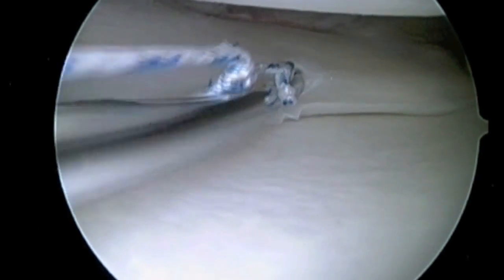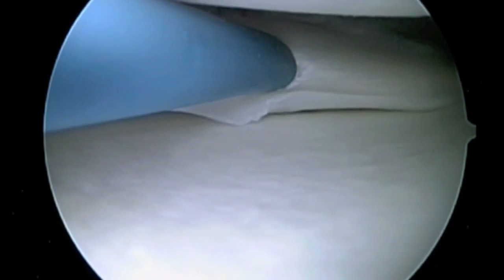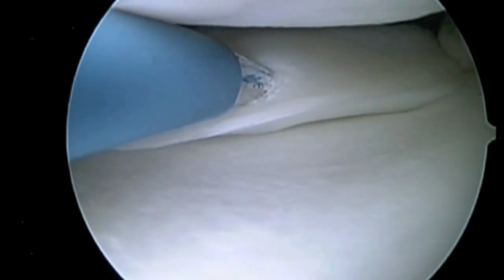Here a meniscus suture device is introduced into the meniscus. One limb of the suture is brought across the tear, and the other limb of the suture will be used to go across the tear at a different position.